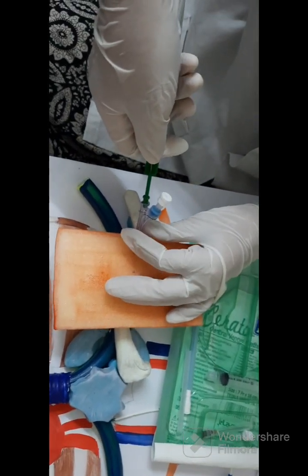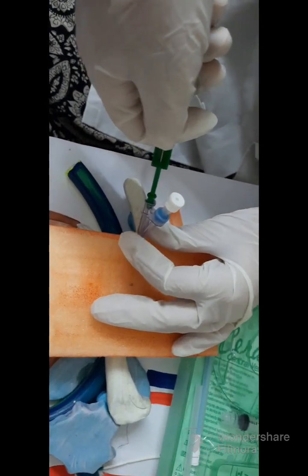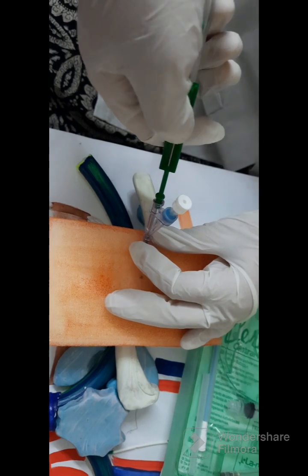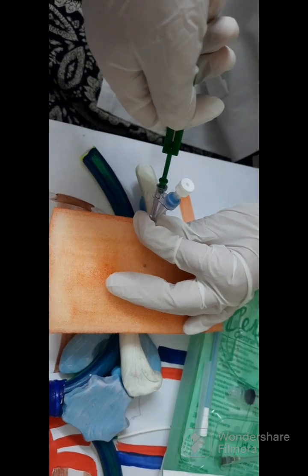Now, as you can see, we are inserting the J-shaped guide wire. This wire should pass easily. Then we will keep holding this wire.